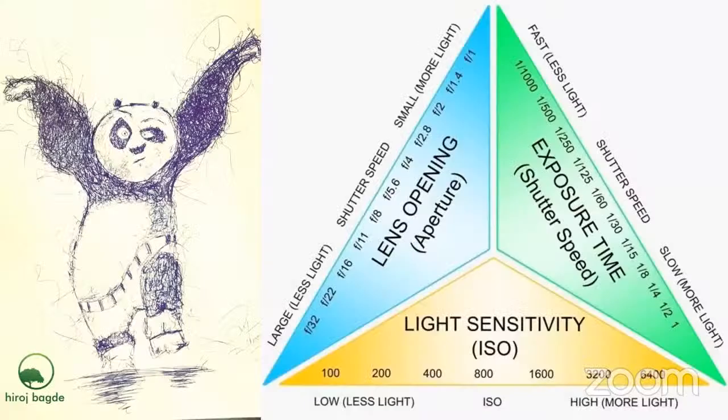The shutter speed means when I hit the shutter button, the image is first, there's an image. See, it just opens.